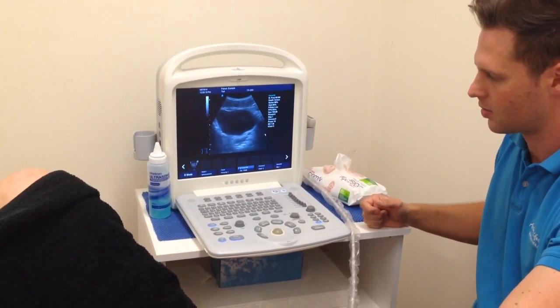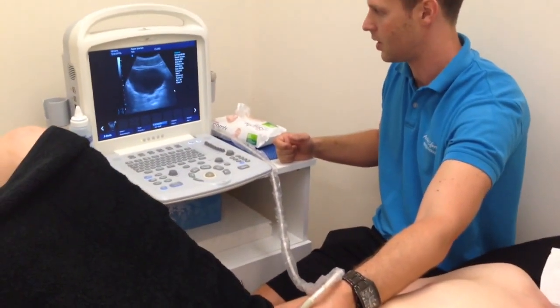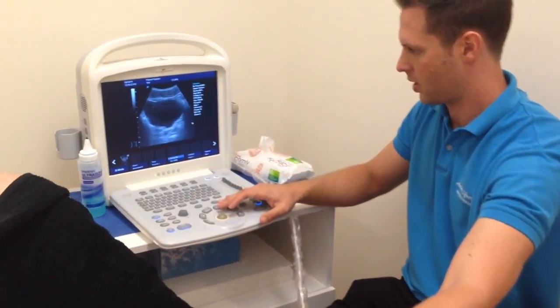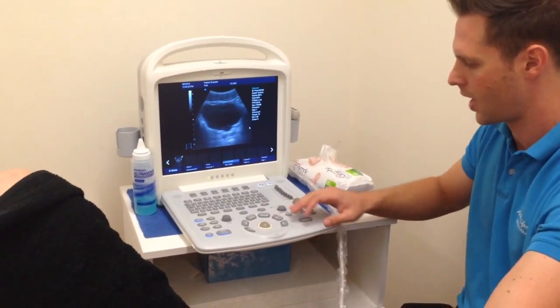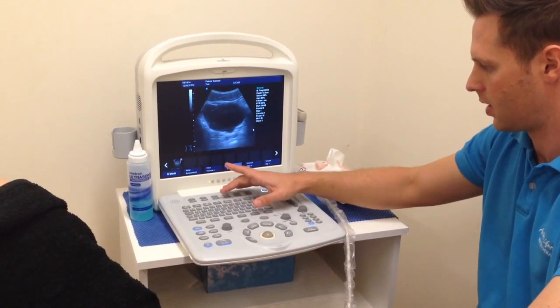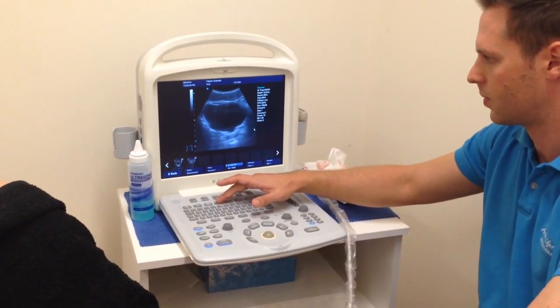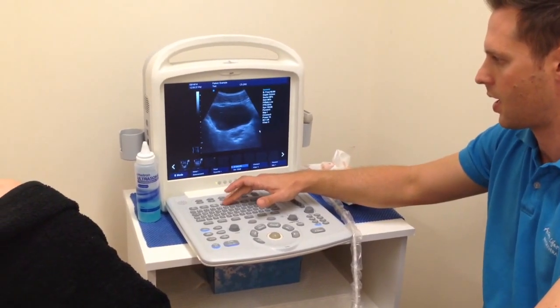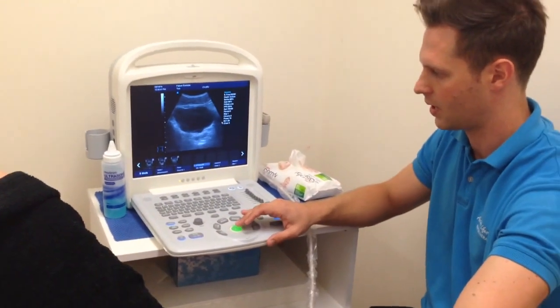Let's change from this view, but before we do, we'll save an image. Just relax everything and get into good position — everything relaxed — and we're going to save that. Then I'll get you to contract for me, and we're going to save that as well. So we'll have both images to look at later.